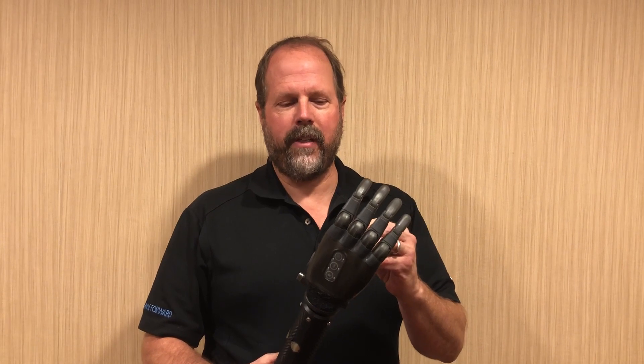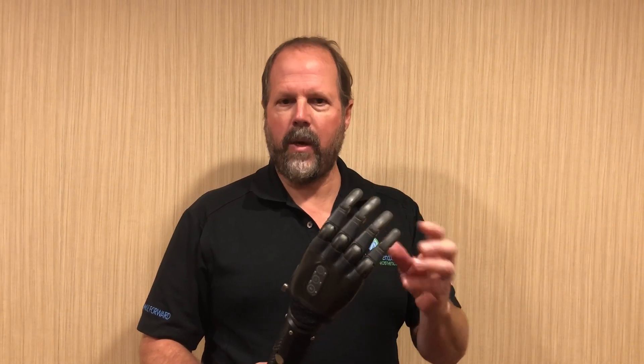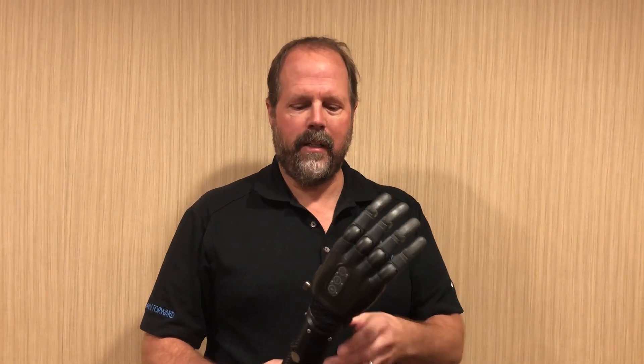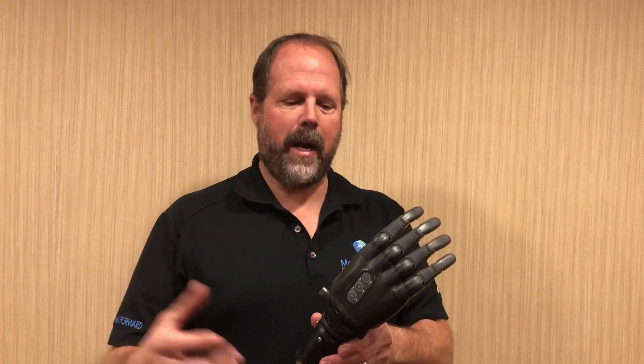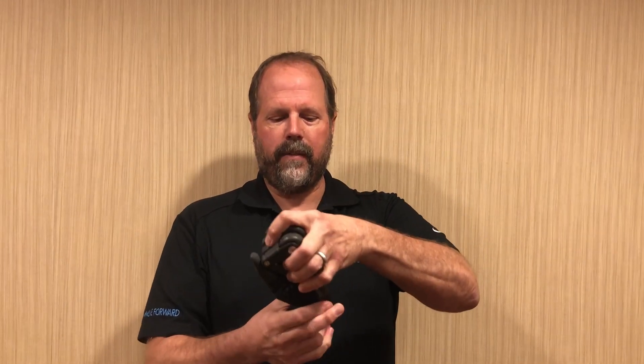It has motorized fingers and thumb to go into the different grasps, easily programmable by the user and easily toggled through by the user. Another great feature of this hand is it has a wrist flexion and extension built into it with a nice sturdy button that the patient can easily toggle between.